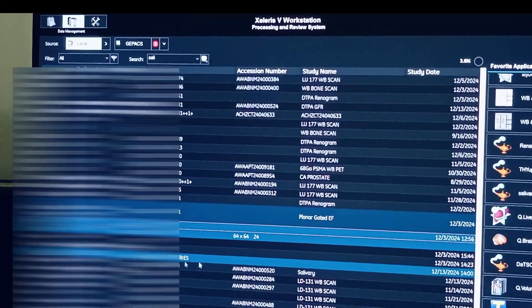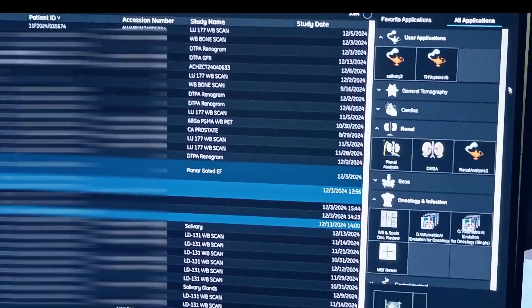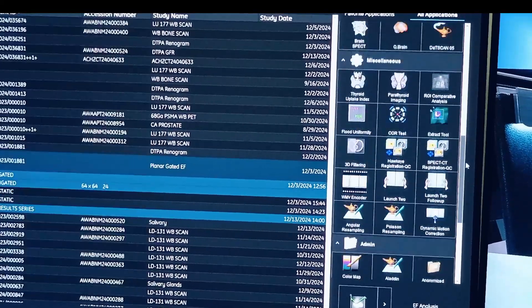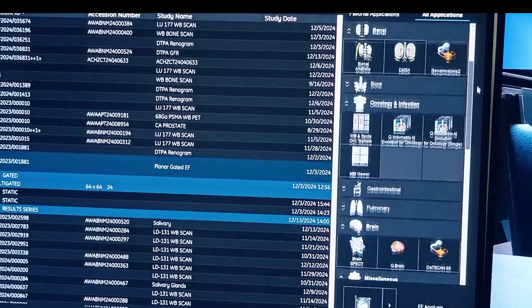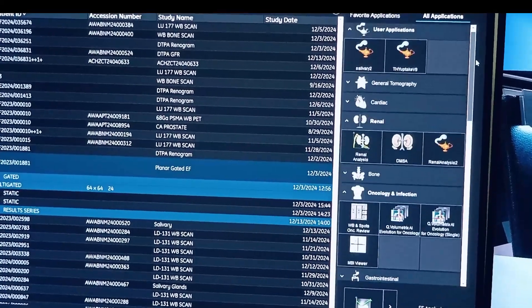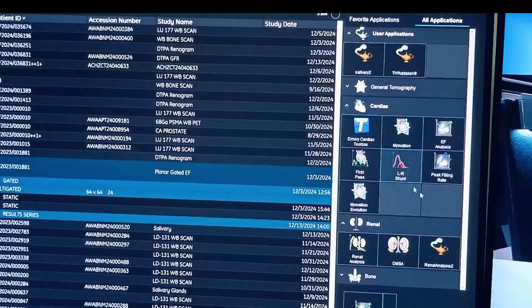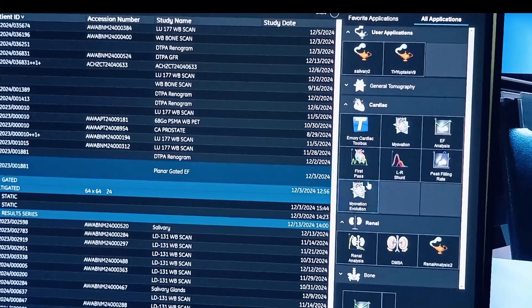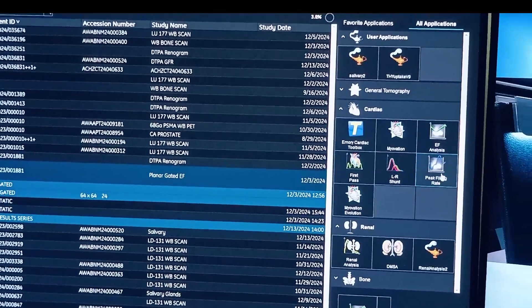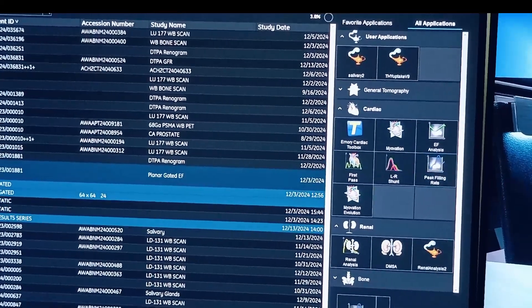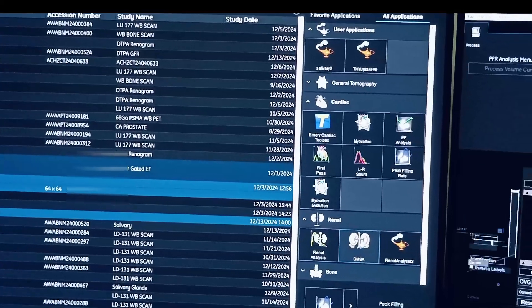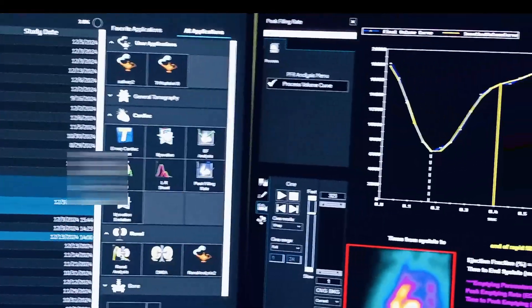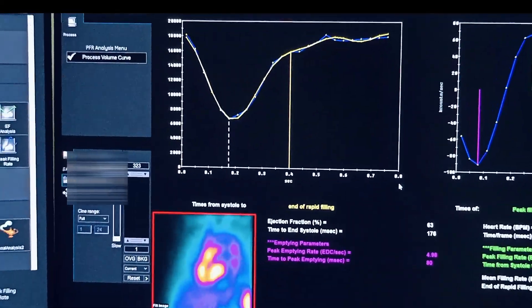And this result you can again open in this peak filling rate. Then here you can see more parameters.